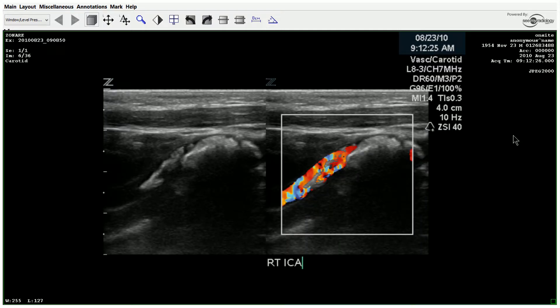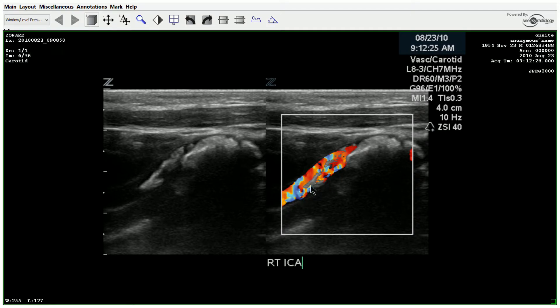Then we move into the ICA, and this is actually a pretty dramatic image. When you look at this, it almost appears that the ICA would be totally occluded. But you do see color and some aliasing here. That is a pretty impressive plaque.